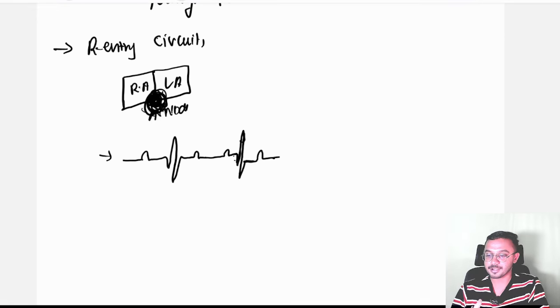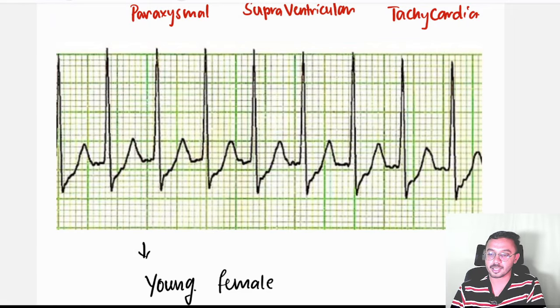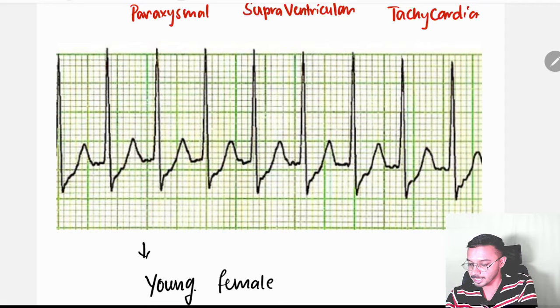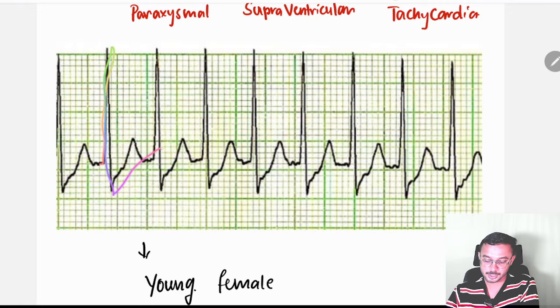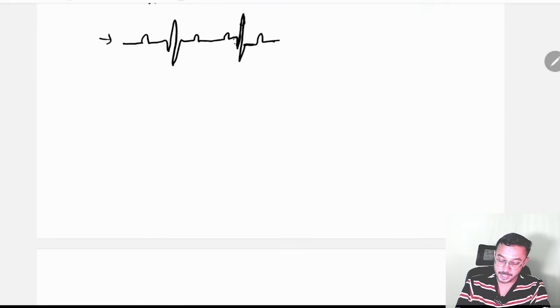Okay, so a young female comes with recurrent syncopal attacks. Think about this. And look at the QRS complex over here, it is very, very narrow. The usual QRS is around 80 to 100, in the sense of 2 to 2.5 small squares, but in this condition it is completely narrow. Look at the QRS complex, it will be a narrow QRS in this condition. Okay, and this is about this. And treatment, very important. Remember, examiner, this is the only condition which will be seen in young patients.